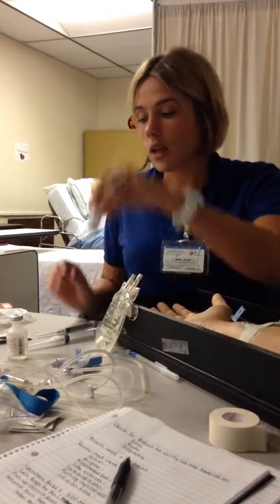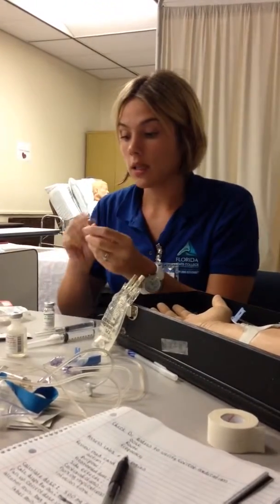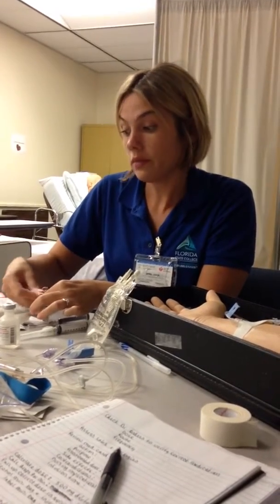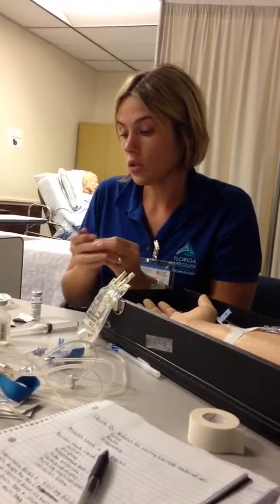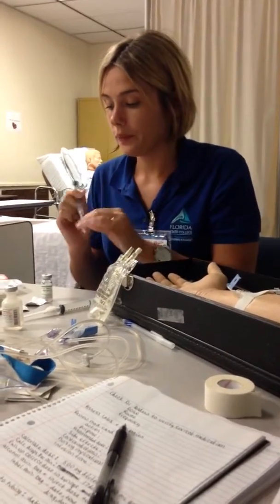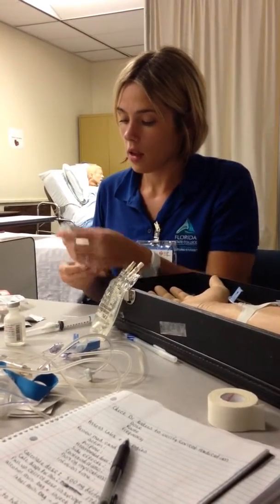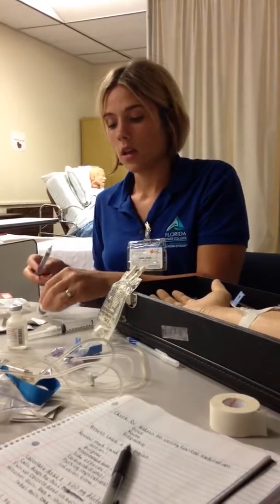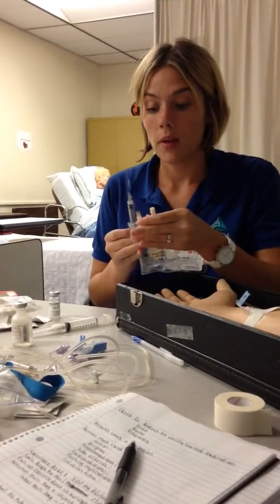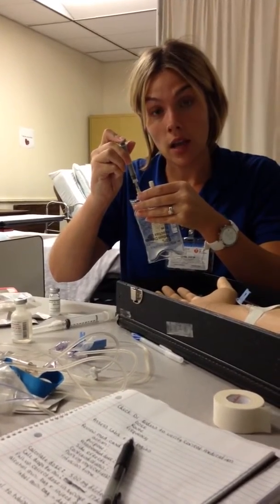Initially, this is my vial of Flagyl that I received from the pharmacy. I'm going to go ahead and clean the tip to keep aseptic technique. And I am going to draw up 2 mLs. I pull back, inject air, pull back, yep, I have my 2 mLs. This is a sterile bag, so I'm going to pop off my cap and inject my 2 mLs in my mini bag.